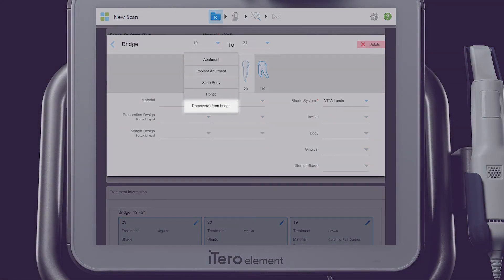For teeth in the span of the bridge, notice the Removed from Bridge option. This can be used to provide information for the lab in cases where that tooth is missing and will not be included in the bridge.